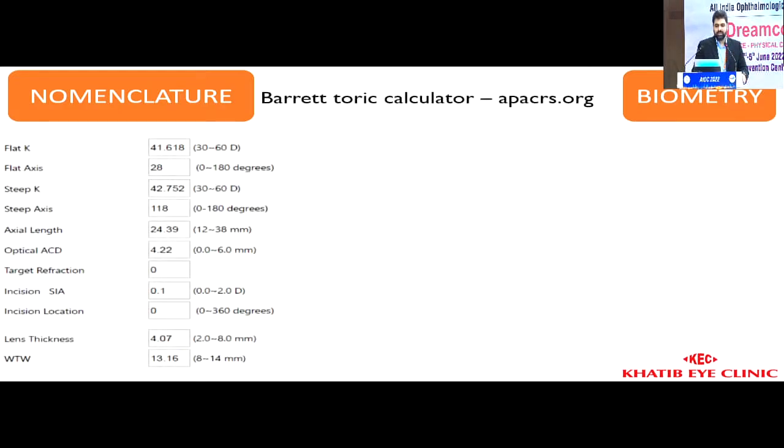Coming to your other two theoretical parts, that is your biometry and nomenclature. When you say toric IOL biometry, you have individual IOL company calculators which have their own, but the safest and the best calculator which you can use is the Barrett calculator, which is freely available online. For the latest version, you should go to apacrs.org and go to the Barrett Toric calculator and just feed in the details there. That will give you the best results.